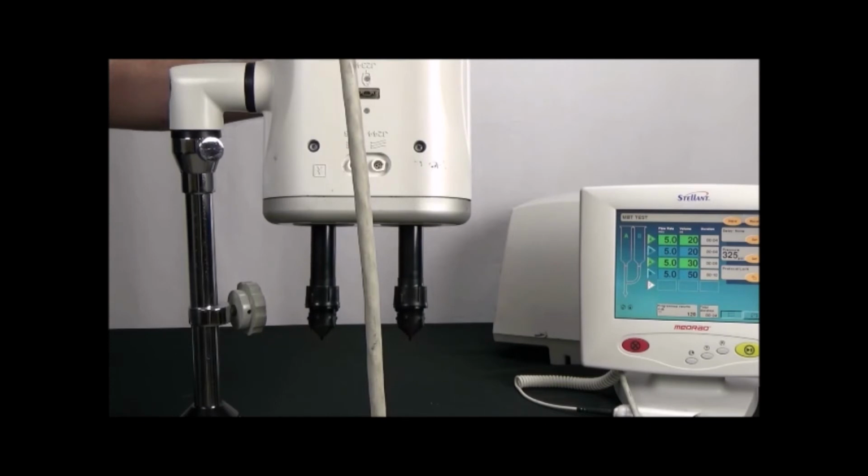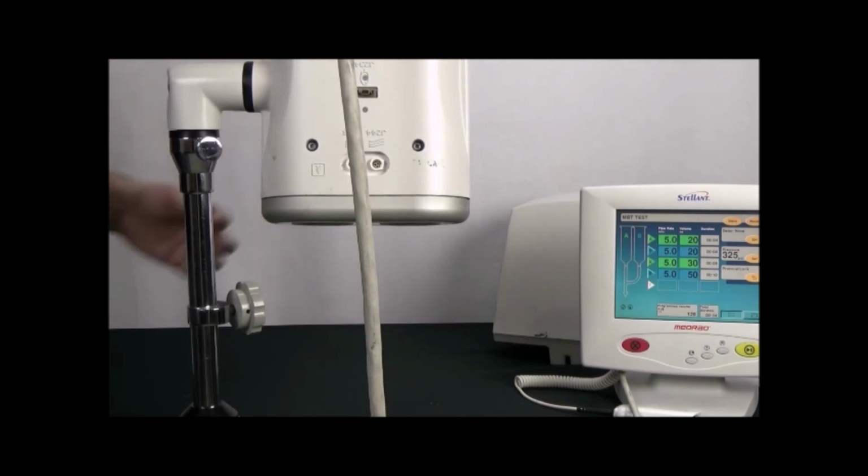The reason we're doing this is because there's an O-ring inside the injector head designed to act as a barrier to keep any spilled fluid out of the head. This O-ring may have a small amount of dried contrast or saline built up on it, which can cause squeaking or even rattling of the piston during movement. The moisture on the pistons will help clean the O-ring off as it is retracting. Leave the syringes fully retracted.